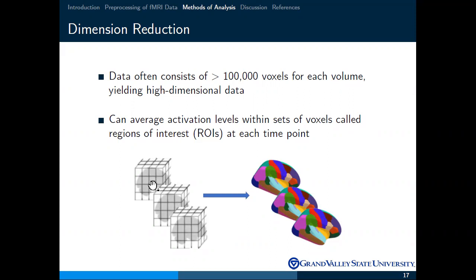Before, if you had a single voxel being important in predicting, say, Alzheimer's disease status, that's not as meaningful as if you had, say, the parietal lobe being implicated in Alzheimer's disease status. So having it aggregated to this level can also facilitate interpretability and understanding the results of the analysis.